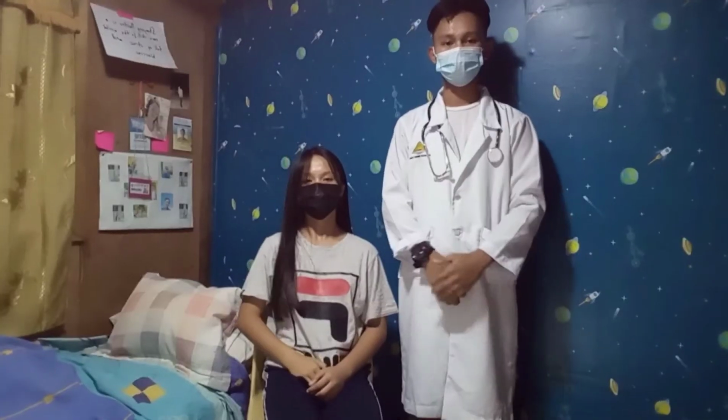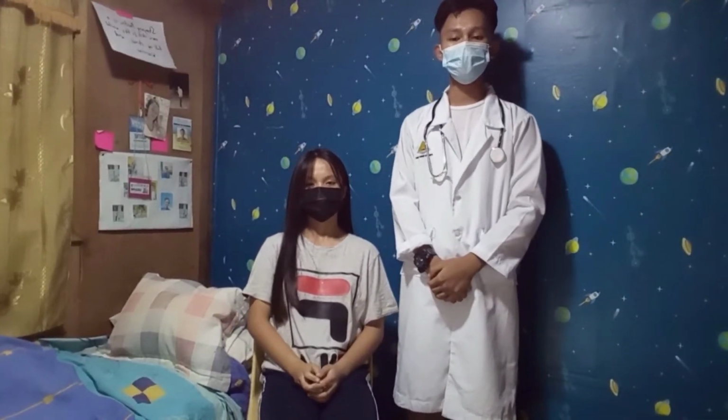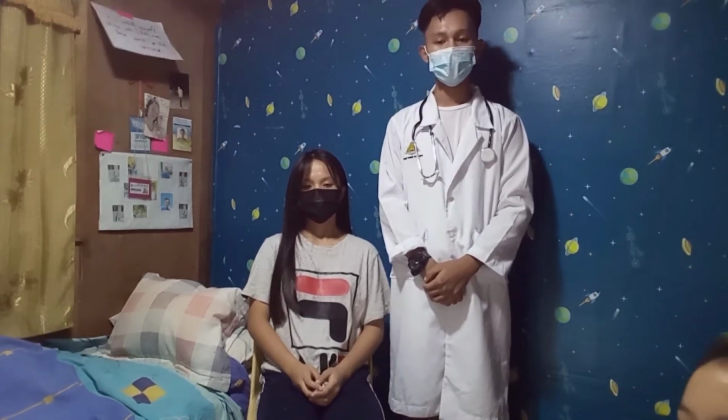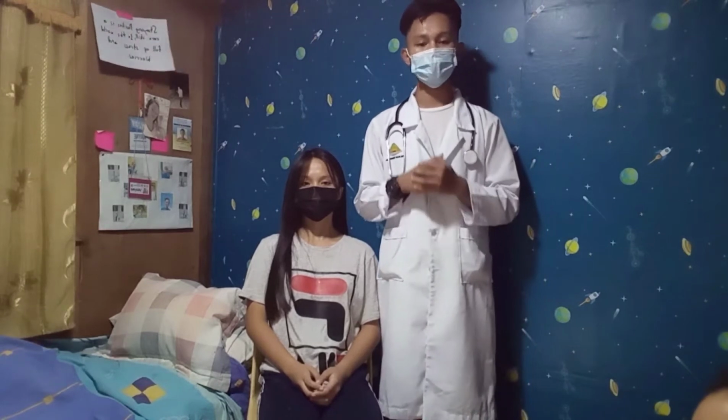Thus, vital signs are monitored periodically. The first thing that I need to perform is the body temperature. It is the difference between heat produced and heat lost by the body, and it is measured through the use of a thermometer. First, you need to greet the client, introduce yourself, and verify the client's identity.